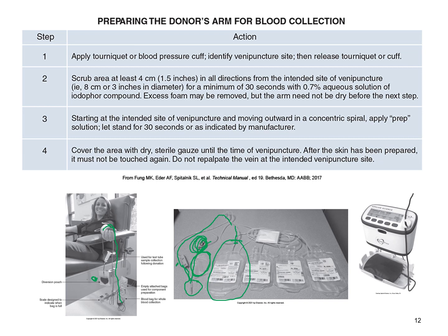And then from this bag, once they've performed that collection, they will have a set of test tubes that they will use, and they will pull off of this little satellite bag to collect that blood so that they're not contaminating this system. And that's what will actually have the donor testing performed on that unit. All of those tubes are labeled, and they're kept with the actual bag, usually rubber banded to it or somehow with that bag, and it follows it through its process until those tubes are sent out for testing or wherever they go for testing.